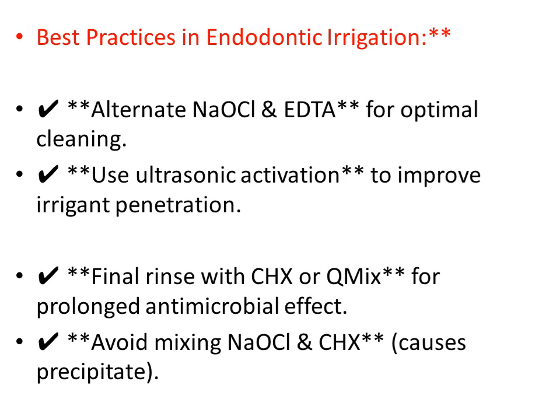Now, at the end, we will conclude with the best practices in endodontic irrigants. First, we normally alternate sodium hypochlorite and EDTA for optimal cleaning and maximum results.